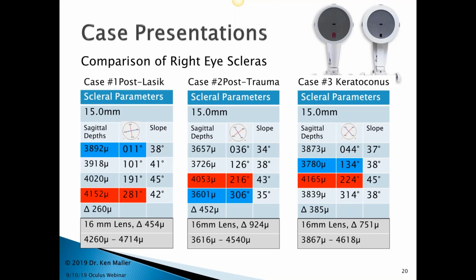So anyone who's been fitting scleral lenses and sometimes runs into that, I think I've done everything right, and you are unable to, in the particular design that you're using, generate a flange that has asymmetry. I think you can see by these 3 cases that don't really have anything to do with each other why sometimes those cases just don't seem to really reach a success. You may be a little tight in one area because you have regular toricity in the flange, or maybe you even have a spherical flange, and certainly that would create these types of problems.